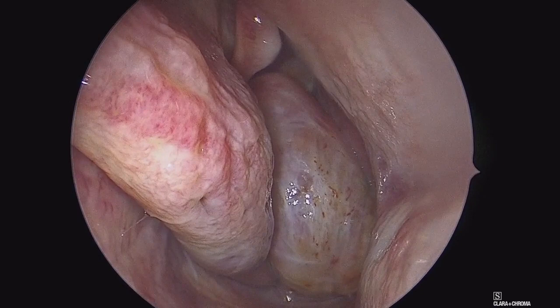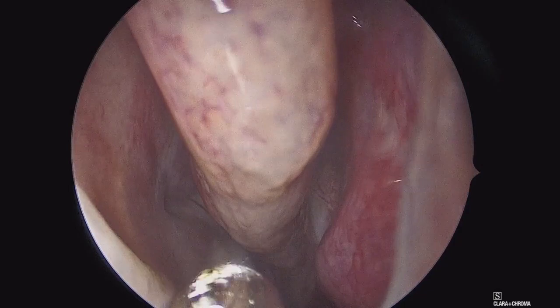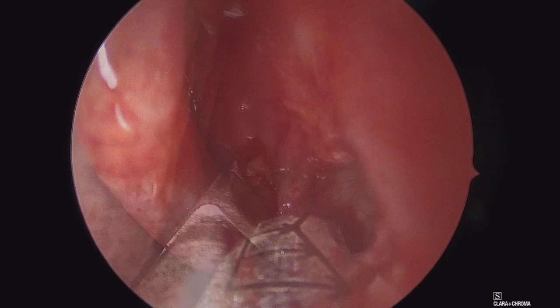Here we look at the nasal cavity on the right side, seeing the tumor filling the nasal cavity, as well as the right septum and the inferior turbinate, then examining the left side as well. The septum is bowed towards the left side but does not necessarily extend towards that side. In this particular case, we began to work on the left side, mainly to facilitate access.